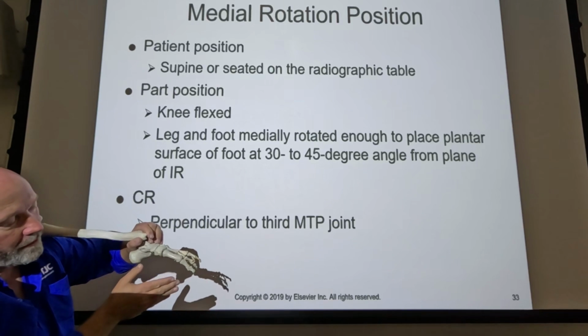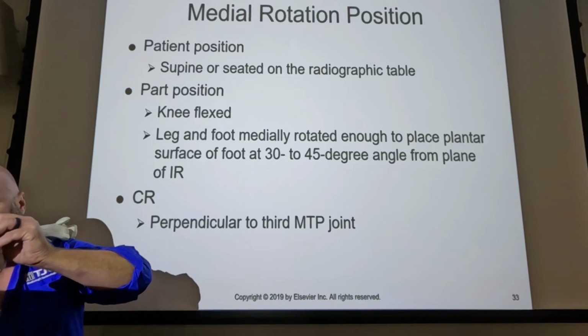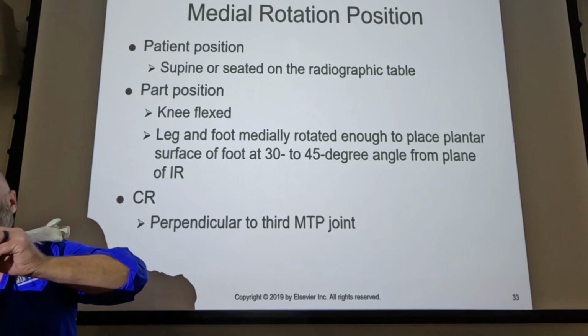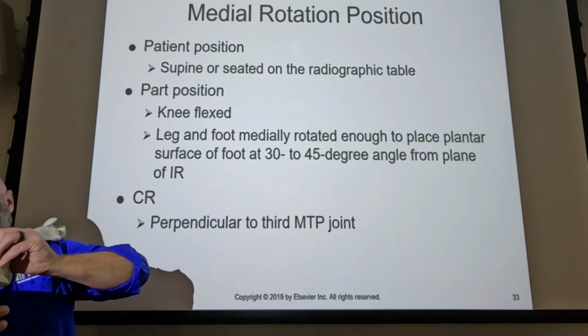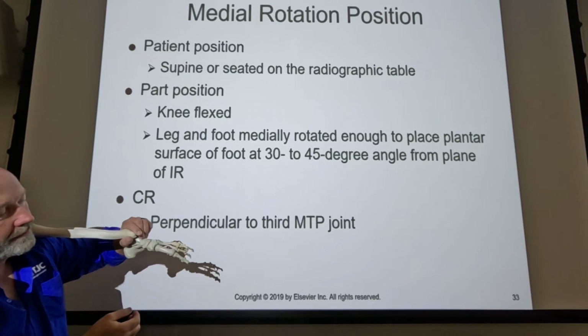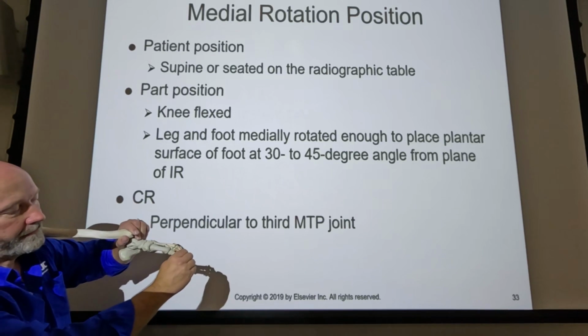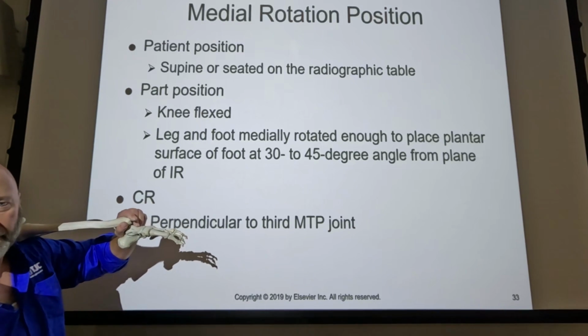But when we oblique up, looking at our foot from the front, or from distal to proximal, the fattest portion of our foot is down here, right? So as we oblique up, look what happens to the toes in relationship to where they were here. They're at a pretty good angle right there, right?